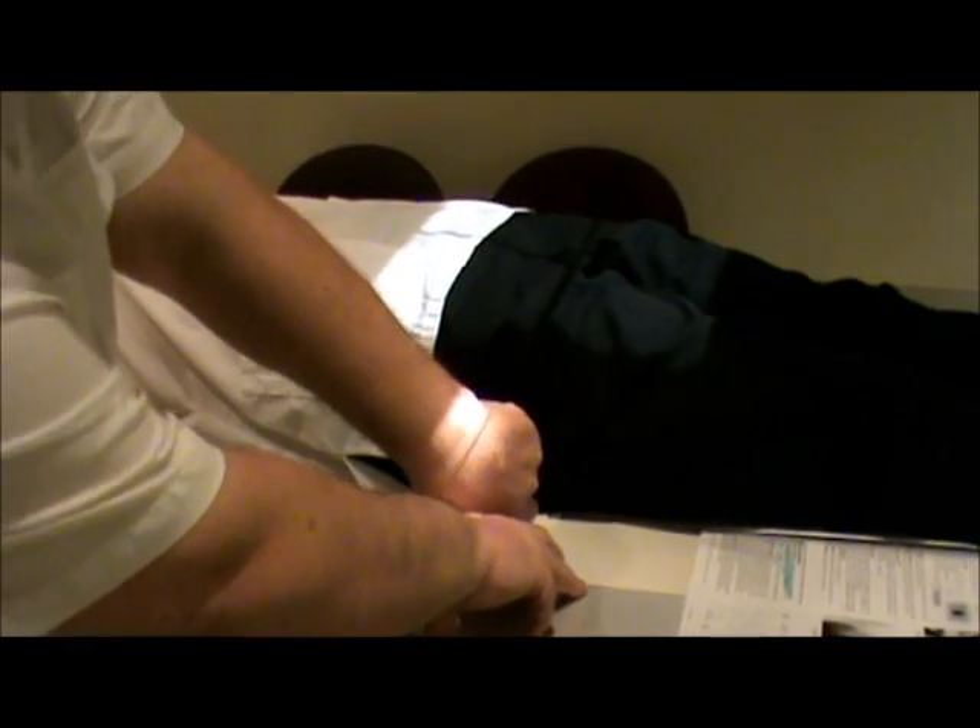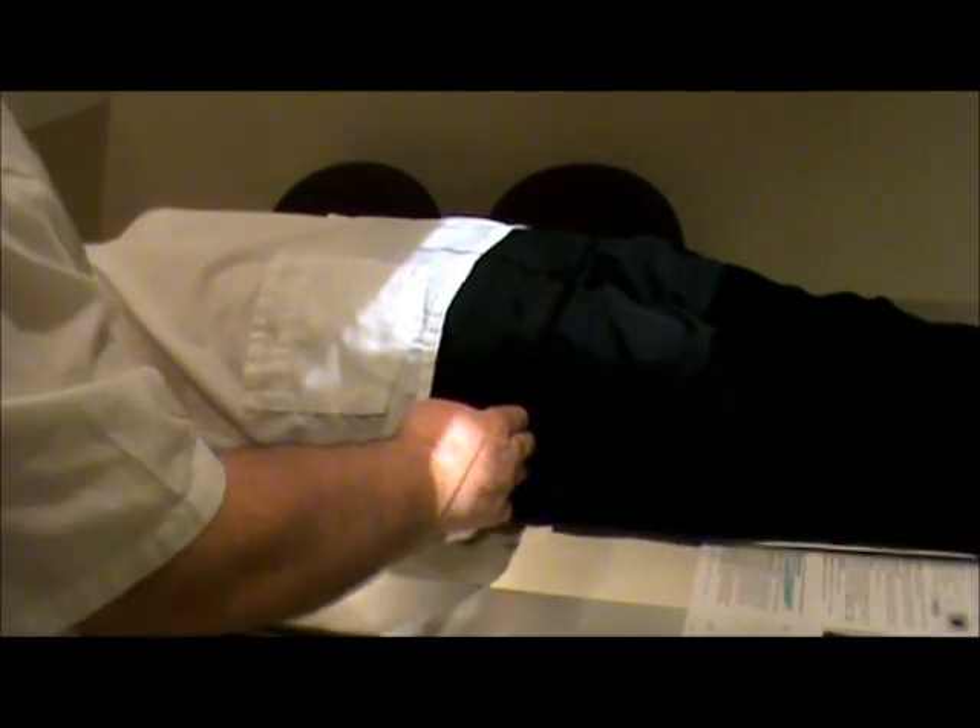Using my finger as the guide, you can see the centering coming out, and it's going to be to the MSP of the patient. Film size remains the same — still going to be a 14 by 17, still crosswise. What you're looking at is a little bit different: you're going to look at the superior and inferior rami of the pubis, and also the body and ramus of the ischium. So the inlet view is for the pelvic ring, and this outlet view — angling into the body — is looking at those structures.